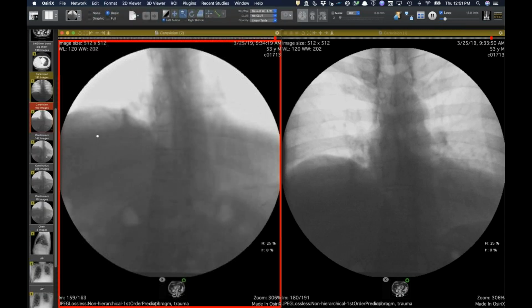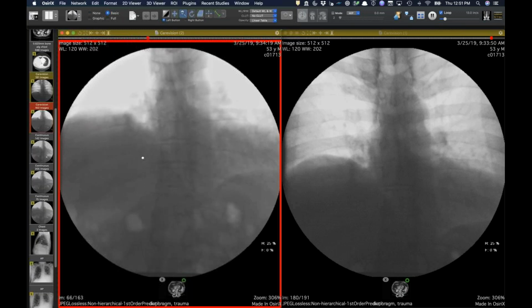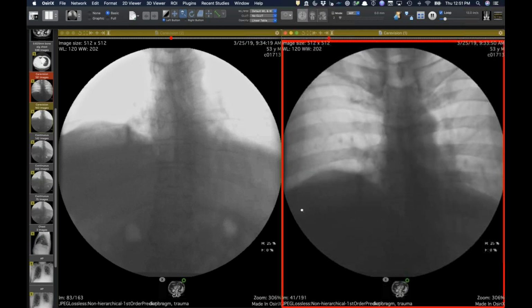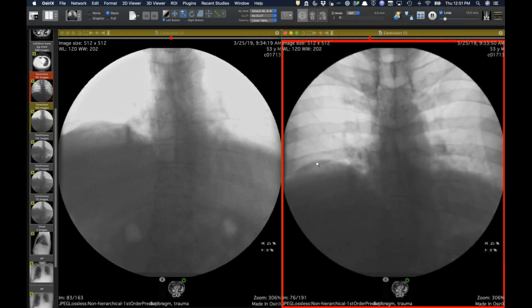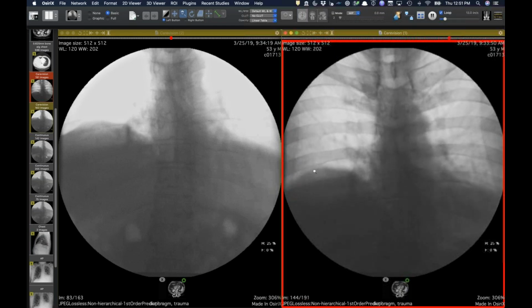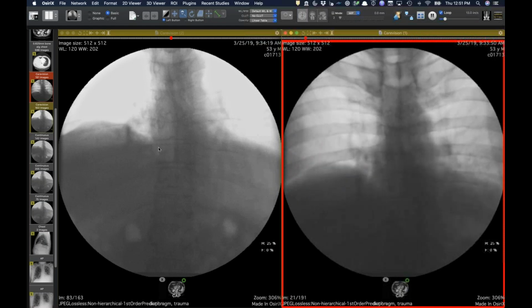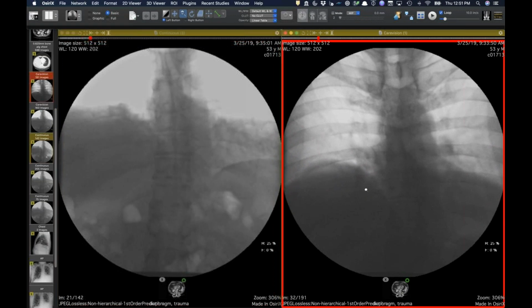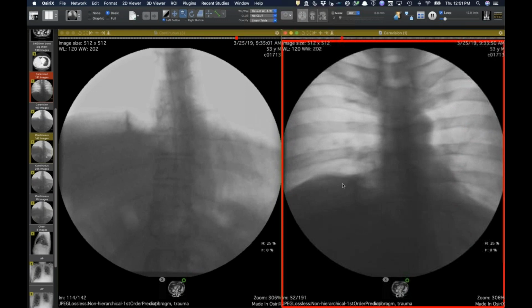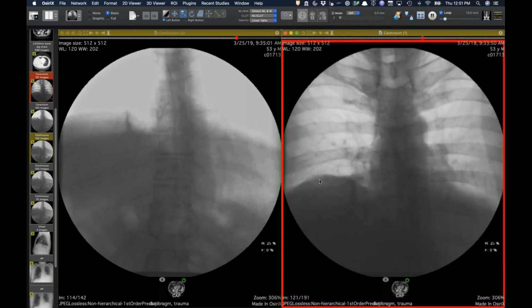And yeah, so it's definitely weak, but what really counts is not the sniff, but the quiet, slow, deep inspiration, to see if there's any orthograde motion that will distinguish weakness from paralysis. If there's orthograde motion on a slow, deep inspiration, then it's probably not paralyzed. Now, there's very little motion there. It's less than half a rib interspace. I usually consider one rib interspace excursion as the lower limit of normal. As normal, yeah. This looks like it's about a half.